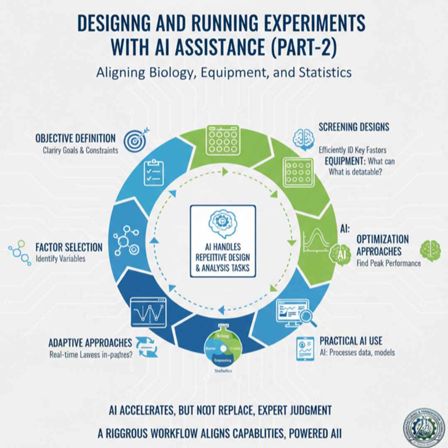Precisely. In a standard factorial design, the math assumes all your factors are independent. But in media, they're constrained. They have to sum to 100%. If you use a standard design for media optimization, you end up with impossible recipes or varied volumes. Mixture designs handle that constraint mathematically. It's all so nuanced. You have to pick the right tool for the right phase.